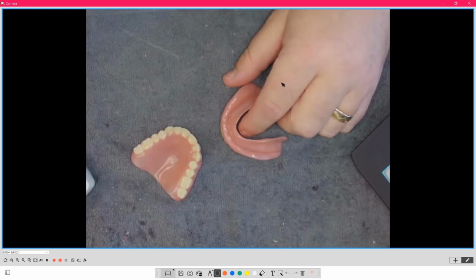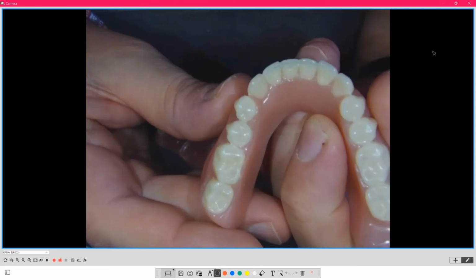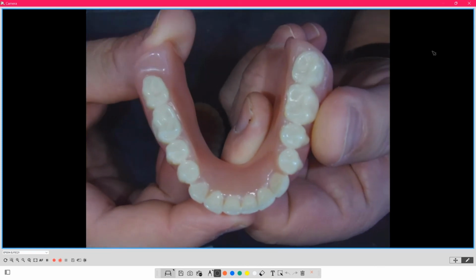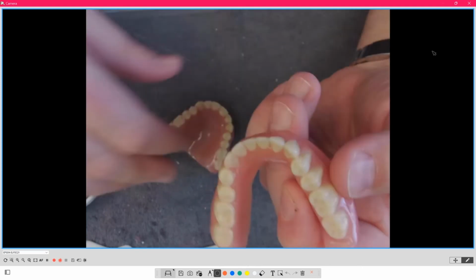Okay, all right, I want to do this with the light on low. Okay, let me get the arrow out of there. This is dense supply. So this is what we are typically taught. This is more of a mill. The teeth have to mill to work.